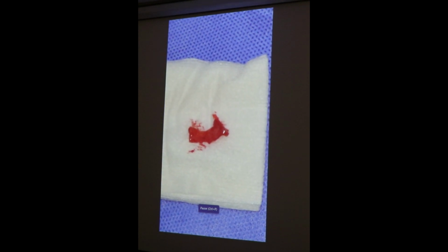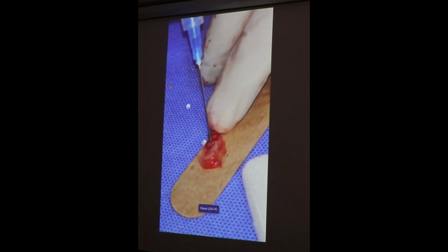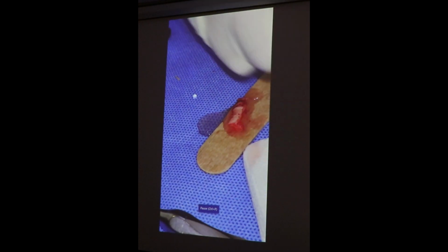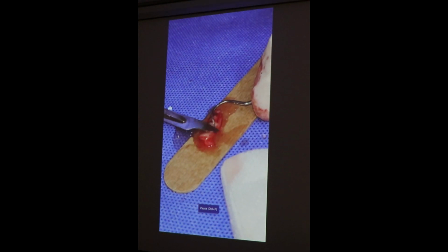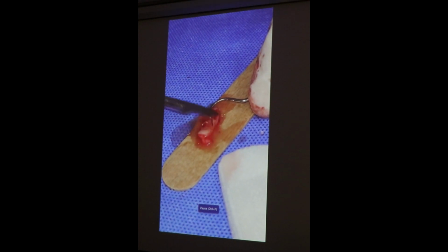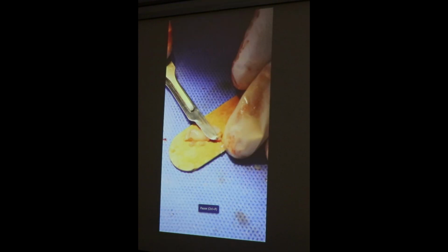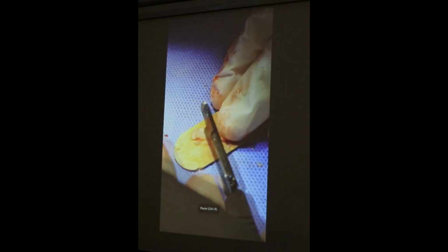Bone density. The osteotomy was... we did not use internal hex. We used internal cone. Internal hex seems to be against you when it comes to zero bone loss. With internal hex, you might have bone loss. With internal cone, you will not have bone loss. Let's come back to this.